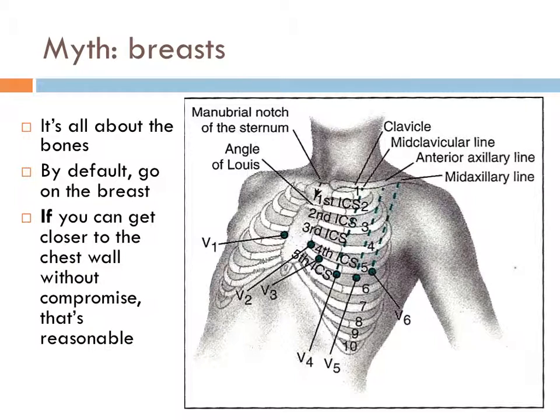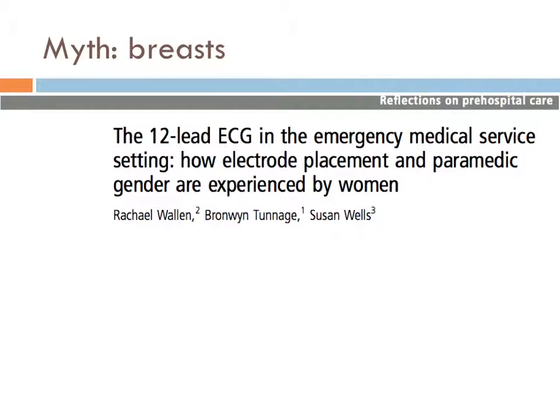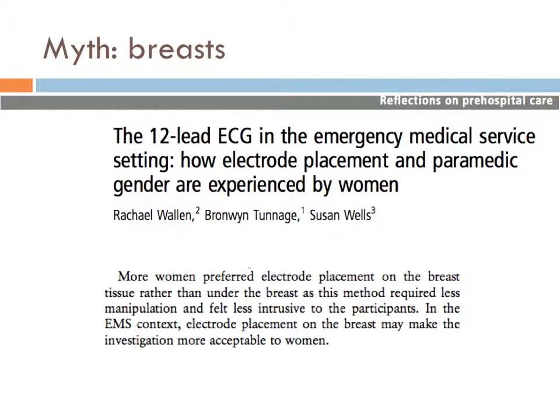Now if you can move the breast aside and you'd be able to put the electrode directly on the chest wall in the correct position, then it's reasonable to go for that, but there isn't necessarily a reason to. One of the other reasons that came up in the literature review that we suggest going on the breast rather than under, there's at least one study that was looking at how women feel when they have electrodes placed on the breast versus under the breast. And in this study, they found that women preferred on the breast placement, presumably because it involved less manipulation of the breast and made the procedure feel less invasive.